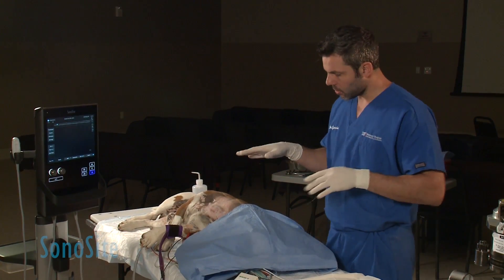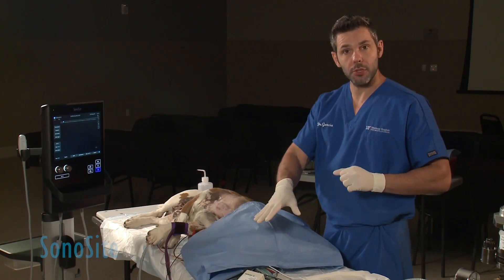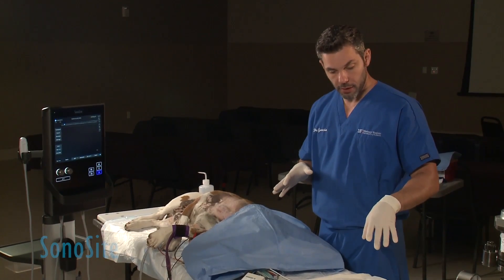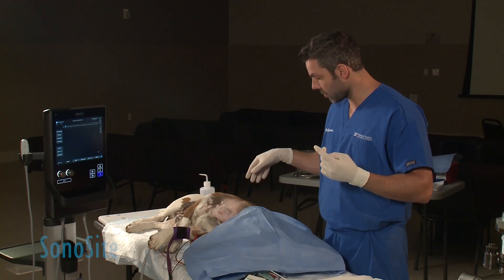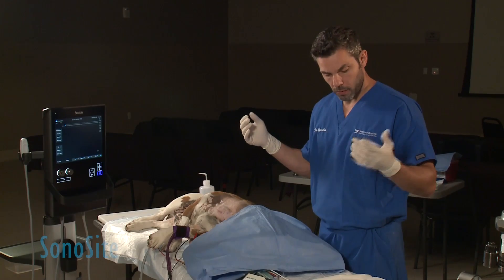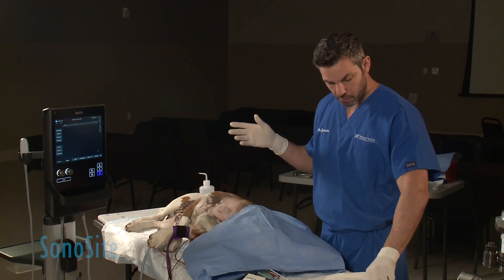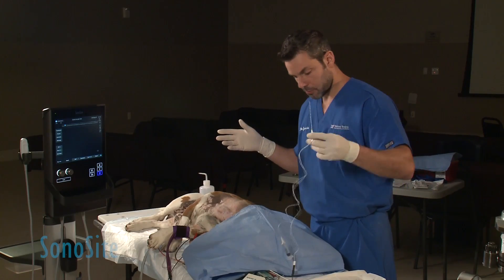Now I have scrubbed the area that we're going to be blocking. The animal is connected to my needle stimulator at 0.7 milliamps. My needle is already primed with the local anesthetic. I don't want to inject any air. I have sterile gloves on. The ultrasound is not covered, so my right hand is going to be unsterile, so I will try to avoid touching my needle with this hand. Only my left hand is going to be touching my sterile needle. I'm just going to remove the cover and have my needle ready.